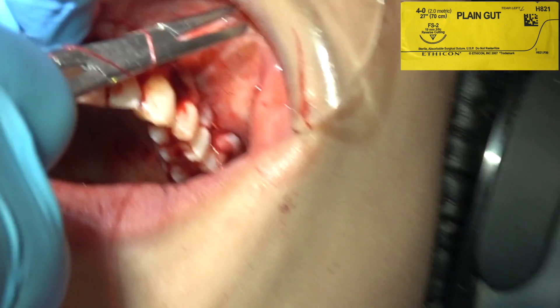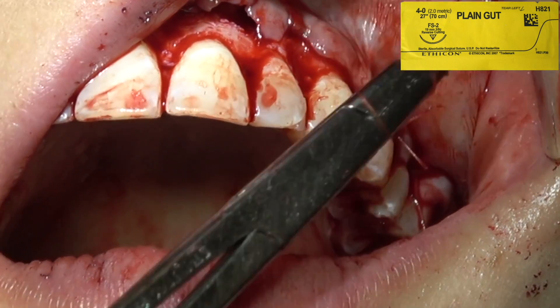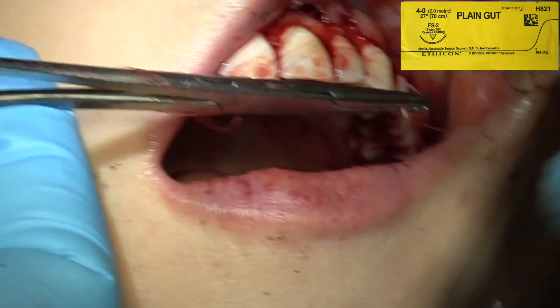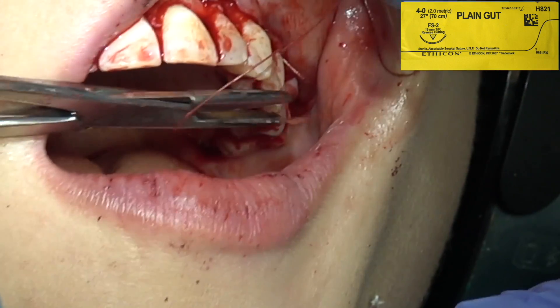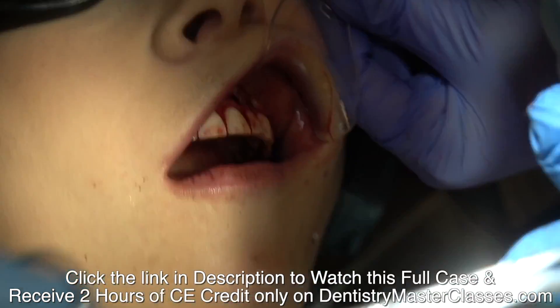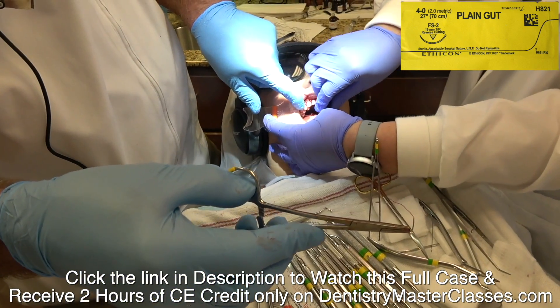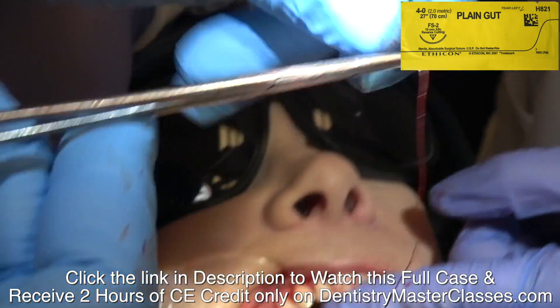We've left the palatal aspect of the papilla — we've not removed that. We've made a cut through here and removed this part, but we've left the palatal part of the soft tissue in the papilla. I'm always rinsing my needle holder with water. You don't want any dried blood on your needle holder or it will prevent you from sliding the suture over the metal.